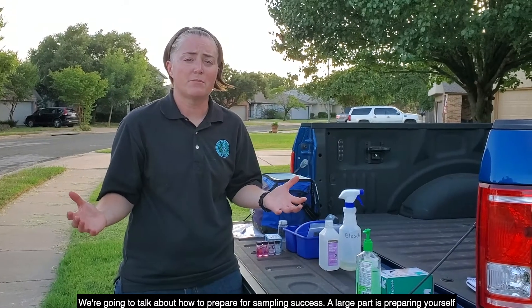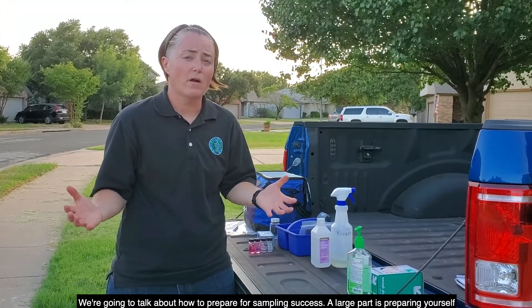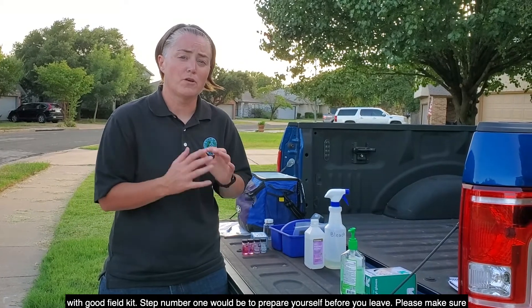We're going to talk about how to prepare for sampling success. A large part is preparing yourself with a good field kit.